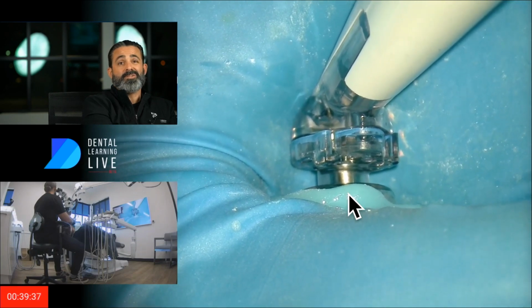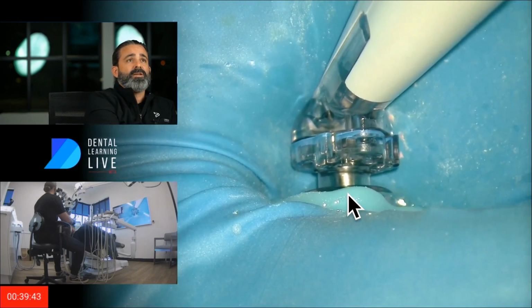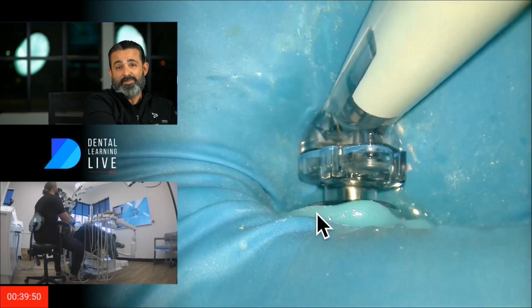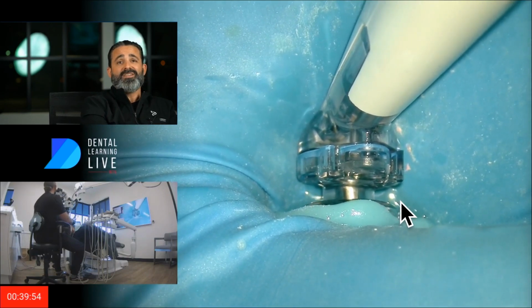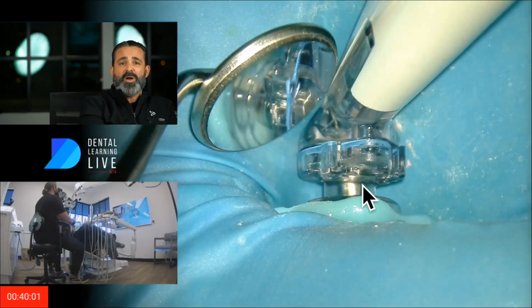Or sometimes the patient moves on me and I'm not paying attention to follow with the patient. Okay, so I'm actually looking, talking to her as she's typing her notes, and I'm actually dictating to her what to write, to be honest. And look, this thing started flooding, and it wasn't a leak, wasn't anything wrong. It was like, oh, Lindsay, come assist, come suction. And I just repostured myself.